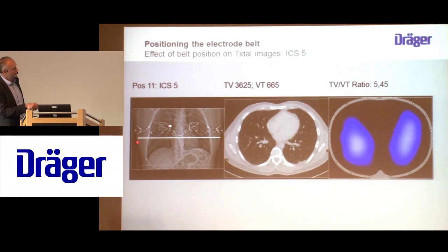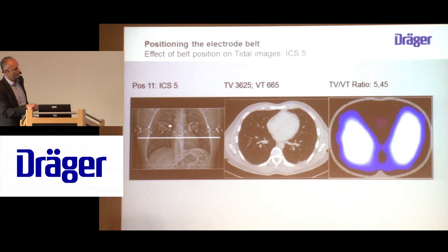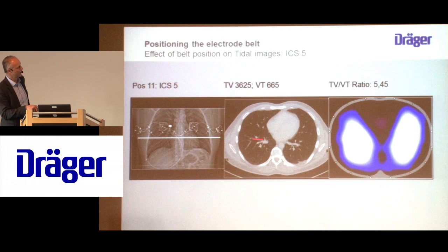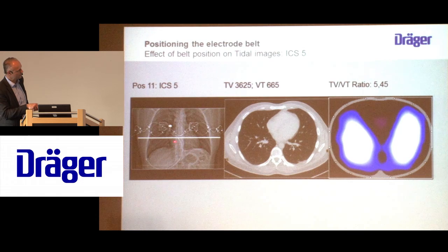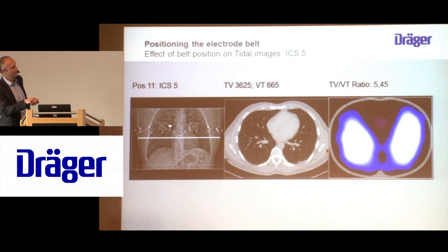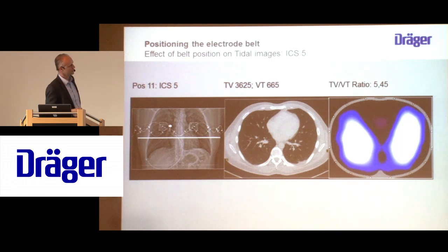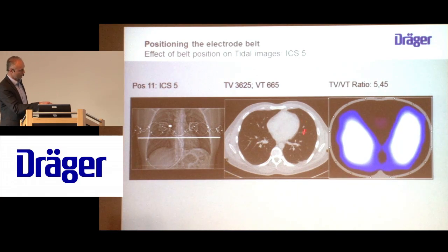Moving down to intercostal space 5, the EIT image still looks quite nice. When you magnify the colors, you can see that this mediastinal space is getting a little bit larger — which makes sense because the mediastinum is shaped like a triangle on the diaphragm, so the lower you go, the larger the space it occupies. That can also be confirmed by the CT scan.